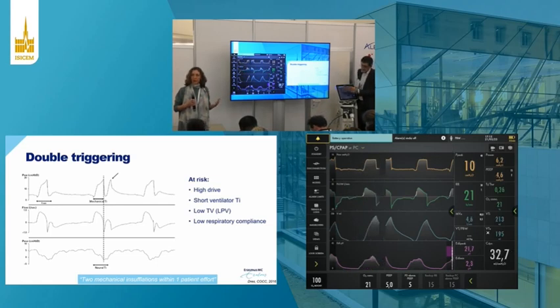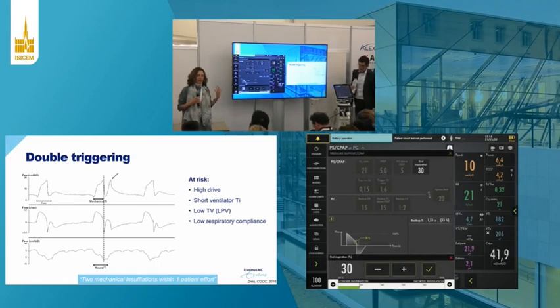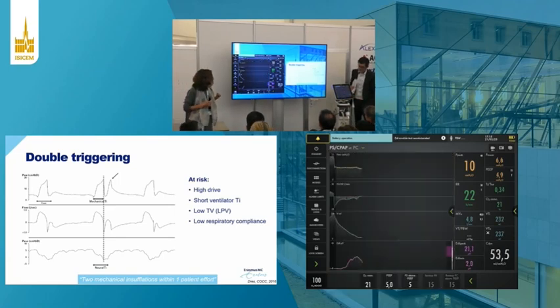But always keep in mind that if the patient is trying too hard, they may feel distressed, they may have very high tidal volume, and this type of asynchrony may also be a marker, not a problem that you solve just by managing the ventilator cycling off.